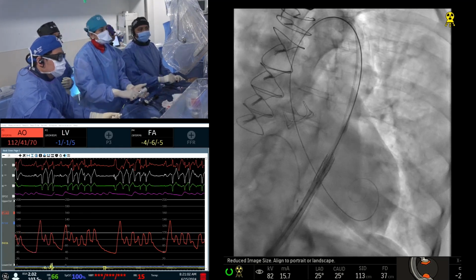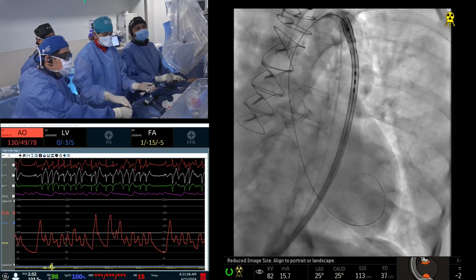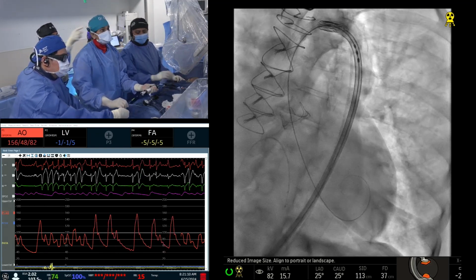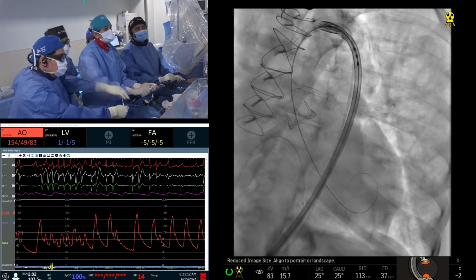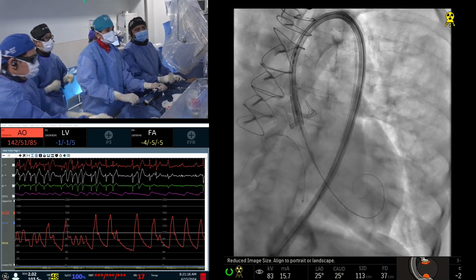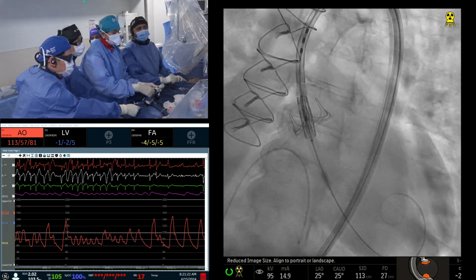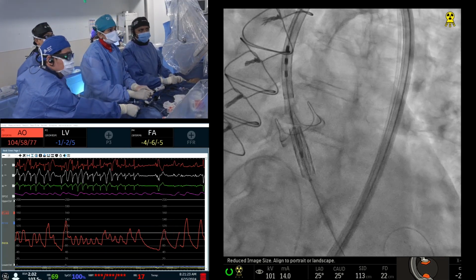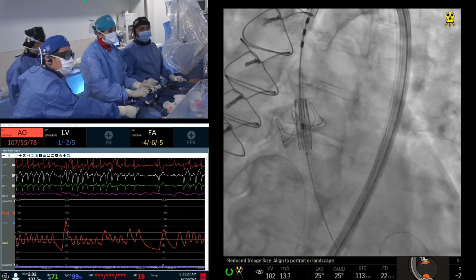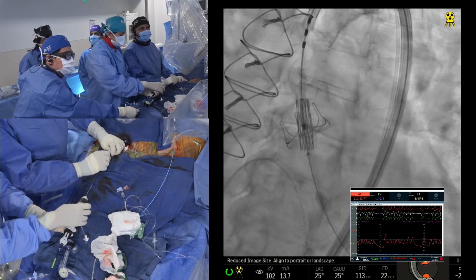This angle, go for it. Okay, go. So definitely they'll put a little extra premium on the Resilia in India. But I think it's a better valve. In the beginning, we were actually selecting which case should get it. Then we made a deal with our Edwards team. I say, this is the better valve. Who cares? Some even 80-year-old sometimes can live till the age of 95. We had a patient who had a CoreValve. Right, lived for 10 years from 80, now 90, and we have to deal with valve and TAV.